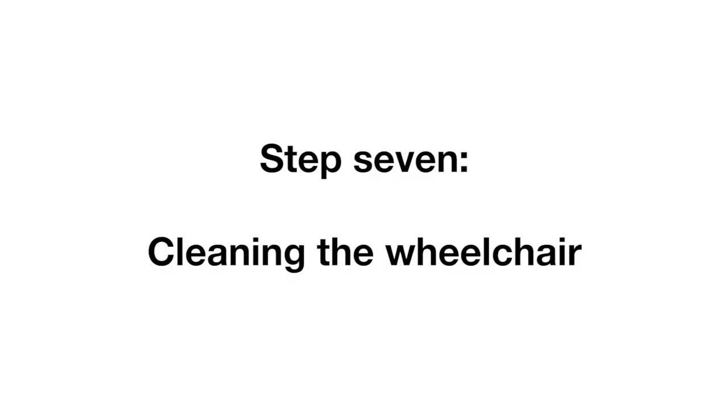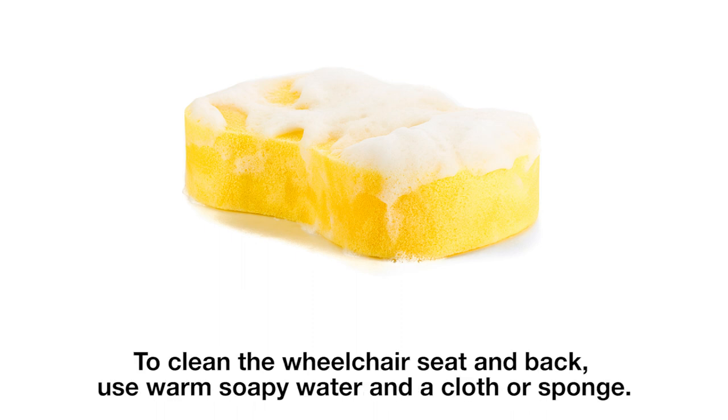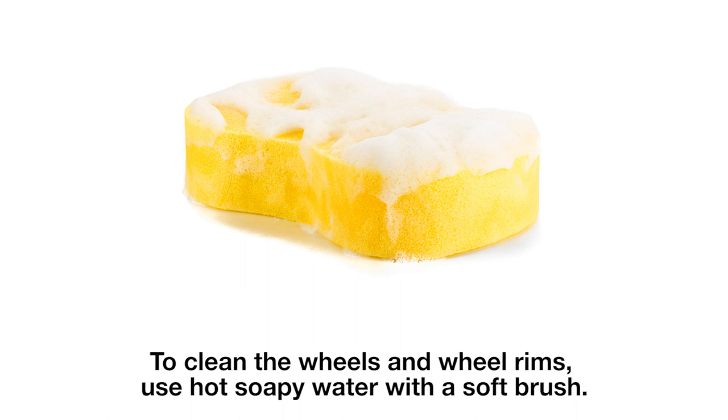Step 7, cleaning the wheelchair. We ask that you clean your wheelchair before returning it to us. To clean the wheelchair seat and back, use warm soapy water and a cloth or sponge. To clean the wheels and wheel rims, use hot soapy water with a soft brush.